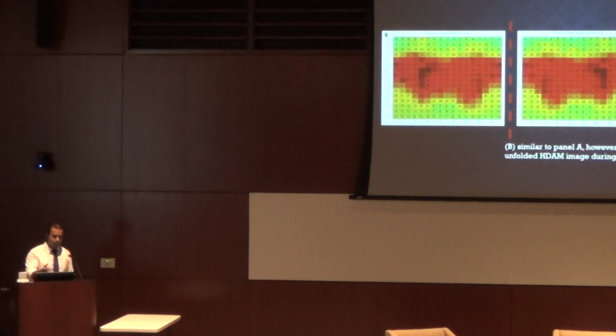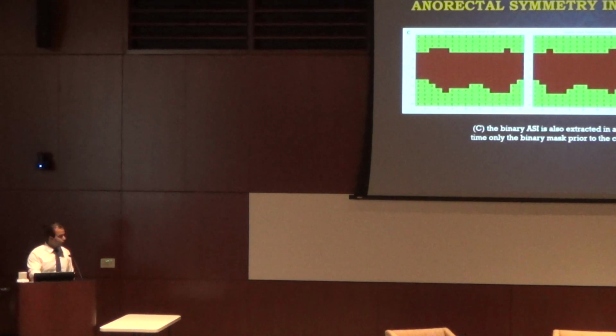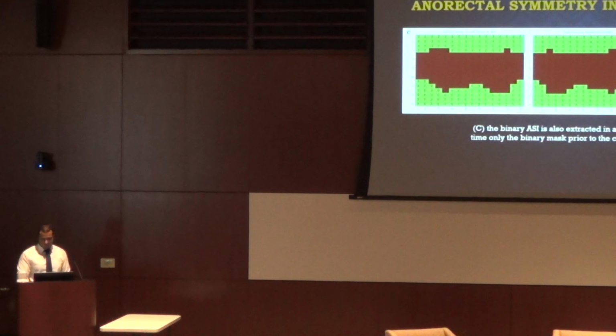Right, now you can use a mean of it, or different measures. You could do the same thing with the same image, but only taking into account the shape. So you got the first image on the left, flip it horizontally, and subtract it, and you could do this vertically too. And for our study, we just use the mean of both vertical and horizontal, but you're free to choose either.